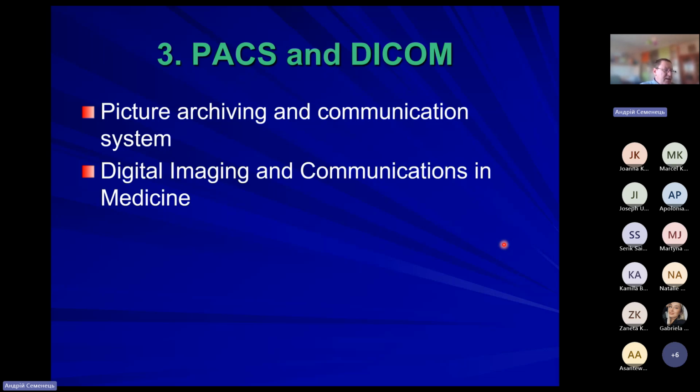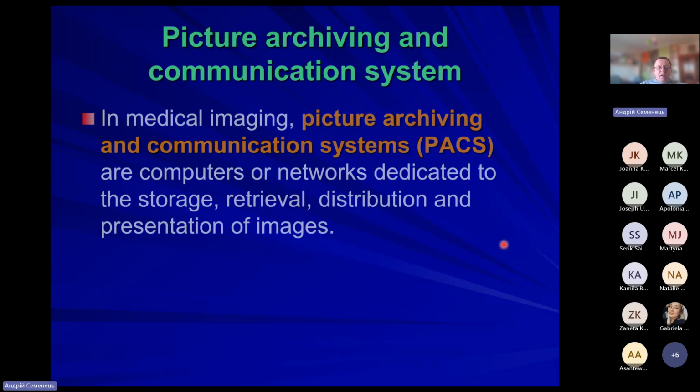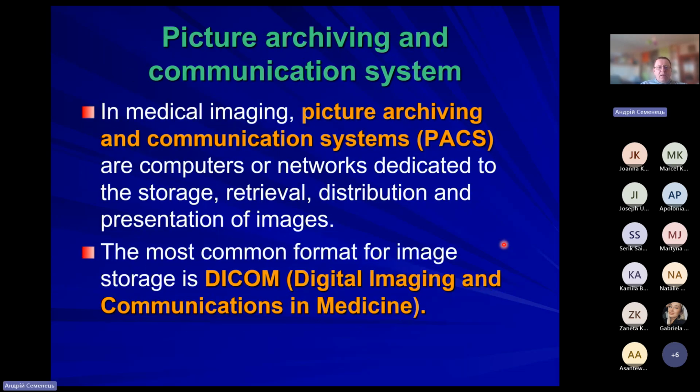Okay, and at this time, I'm going to come to the final question for our lecture, about PACS and DICOM. So, about tools which allow a physician to effectively manage medical images. First of all, if we talk about PACS, we have to understand it's a special kind of computer information system, a picture archiving and communication system, which is computers or networks dedicated to storage, retrieval, distribution, and presentation of medical images.